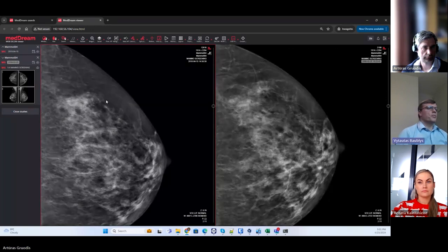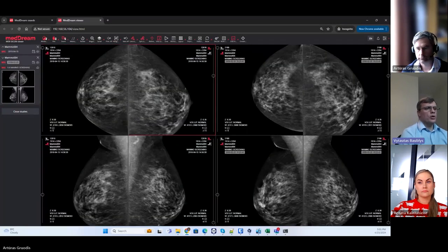So basically, if your application specialist doesn't know how to show the functionality, you can always ask our application specialist to do training for your team, and again, you would be able to present to the doctors the most efficient way to utilize the MedDream functionality.